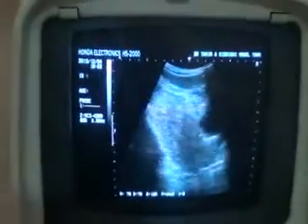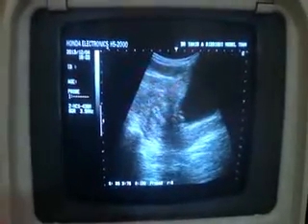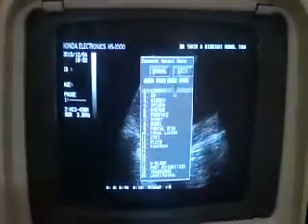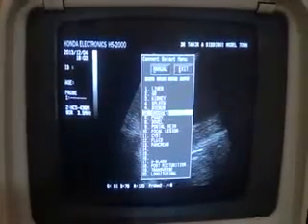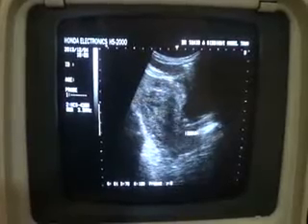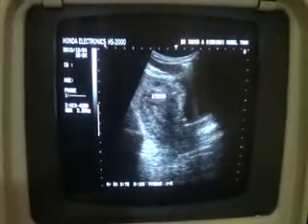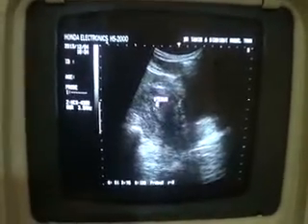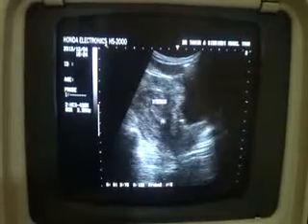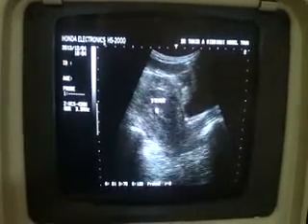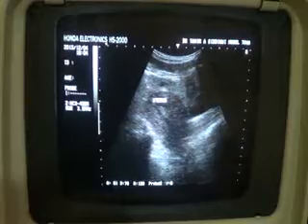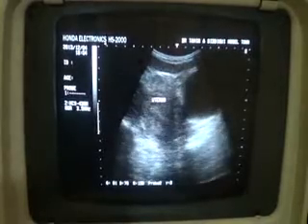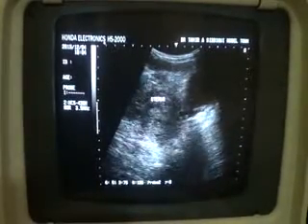I will intentionally scan from the pelvic region. This is the uterus of the female in longitudinal section. This is the cervix and this is the urinary bladder. This is the endometrial canal. The endometrial canal is in early proliferative phase and there is no focal lesion seen in the myometrium. The echogenicity is normal.